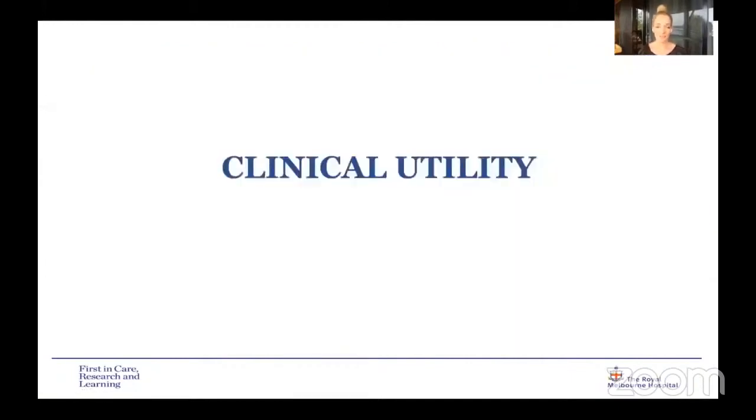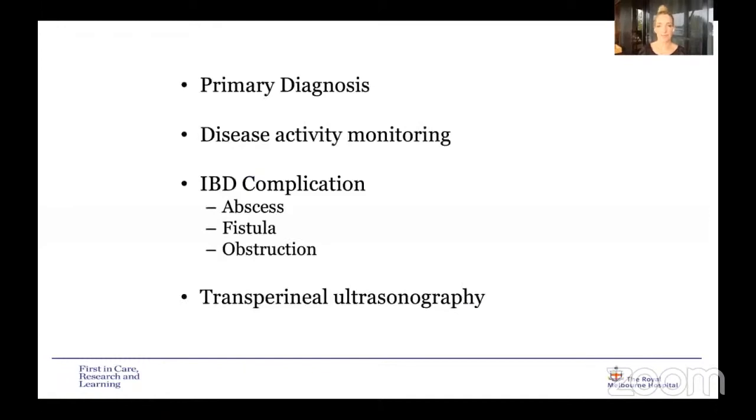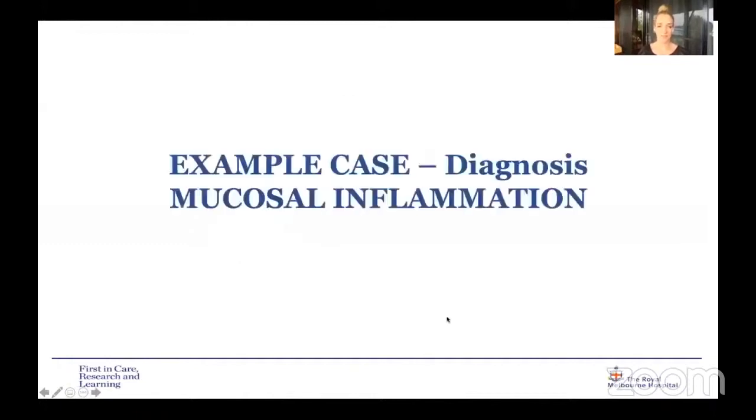So in terms of the clinical utility of intestinal ultrasound, once you start using this technique, you can't imagine doing any clinical practice without it, because it really does transform your care. So there are multiple ways it can be used. It can be used for primary diagnosis, disease activity monitoring, assessing for inflammatory bowel disease complications, including abscess, fistulas or obstructions and strictures, as well as transperineal ultrasonography to analyse perianal disease, but we won't be going through that today because of time limitations. So this is just an example case of how we can diagnose mucosal inflammation.